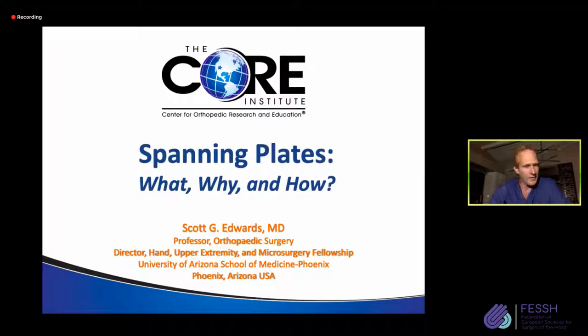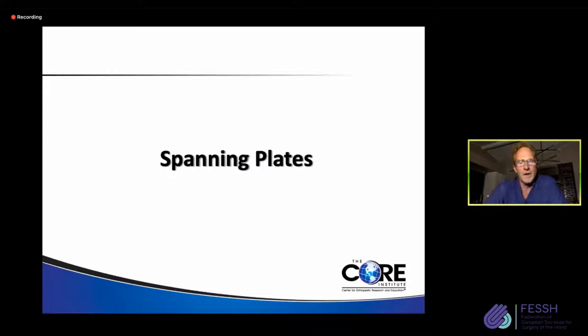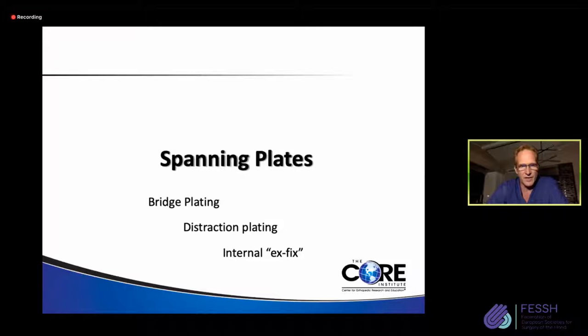So with that said, spanning plates, I just want to explain that it comes with a lot of different names. It's sometimes called bridge plating, distraction plating, or even the internal X-fix. And all these things are terms that mean the exact same thing. It's the same concept. There is not a variation between these things. So the concept itself is actually very simple.